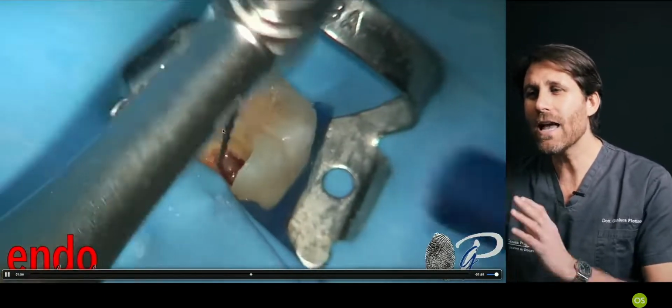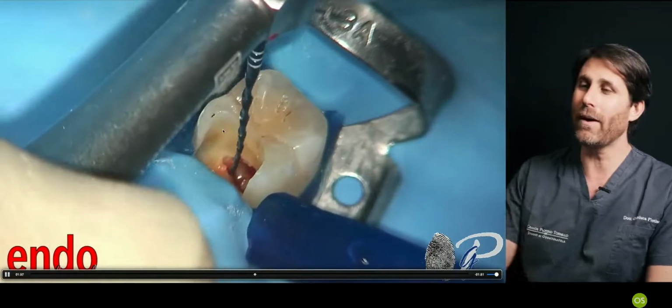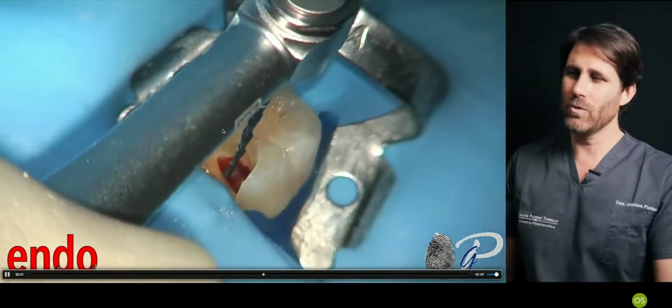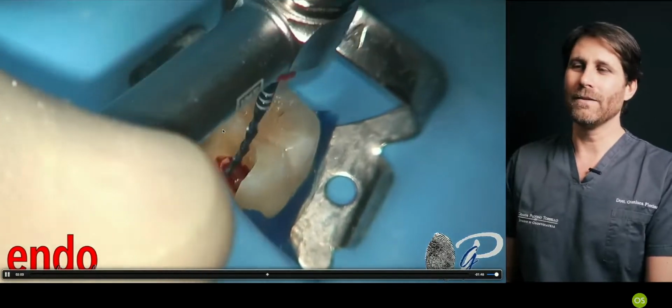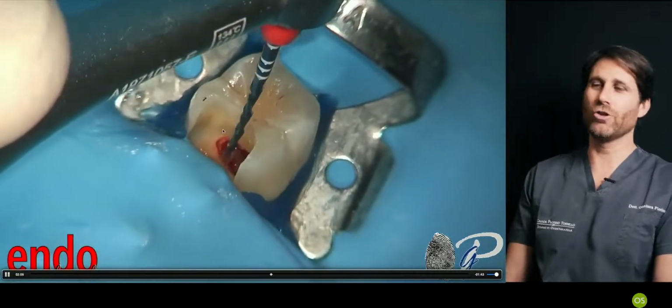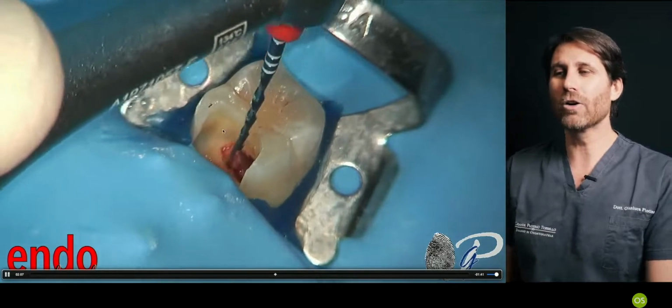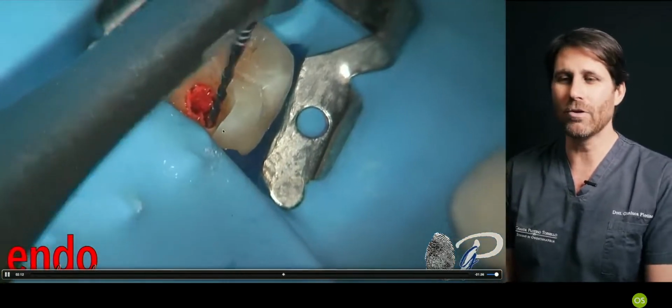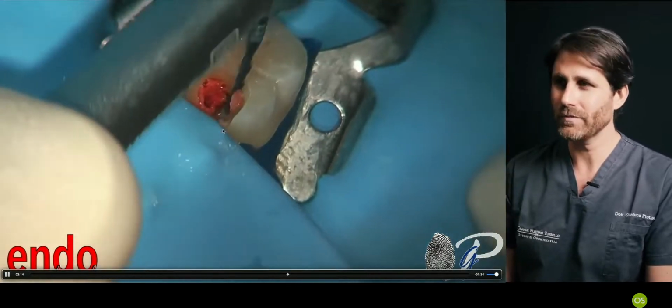And as soon as I have the entrance of the canal, look, this is a pulpitis, it was bleeding. I go inside with an appropriate instrument that we will see further on in this endochannel, and I try to remove the coronal pulp in the coronal part of the root canal to stop the bleeding in these pulpitis cases.